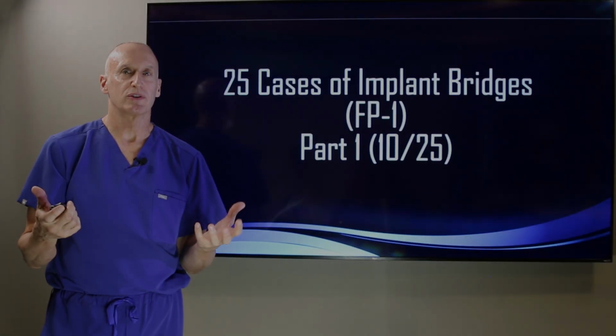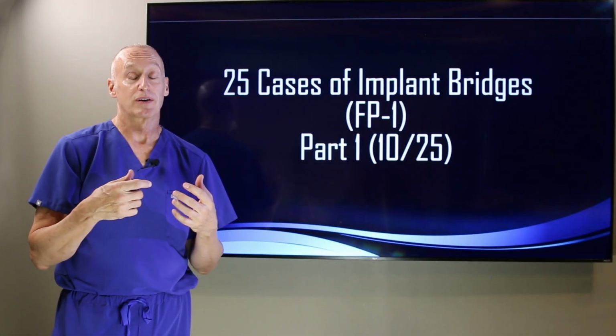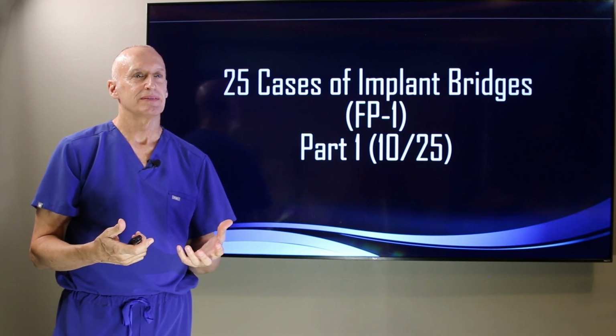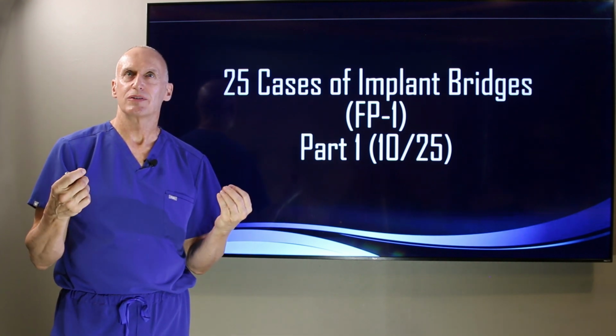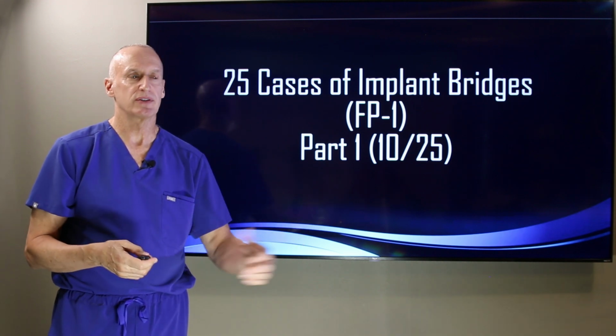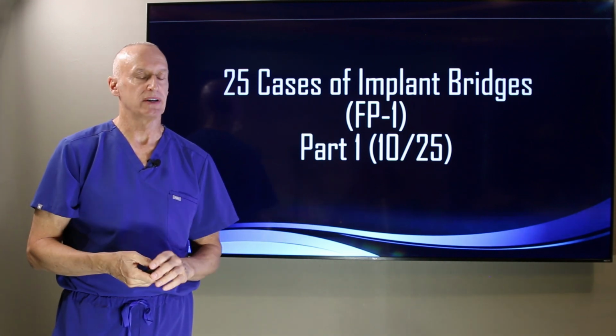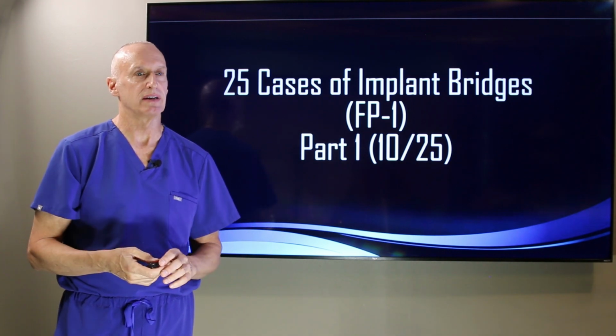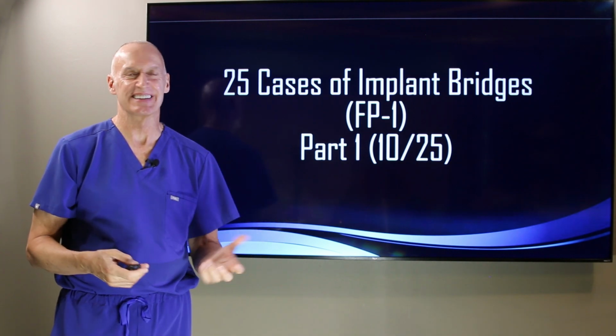So I hope you enjoyed those 10 cases. They are even better than I remember. When I go through these pictures and realize the transformations that we were able to give patients, it's mind-boggling for me too. And this part of it's really fun for me too. It's almost like nostalgia or reminiscing.